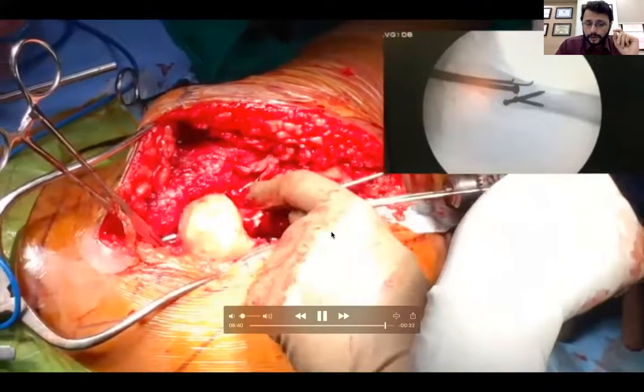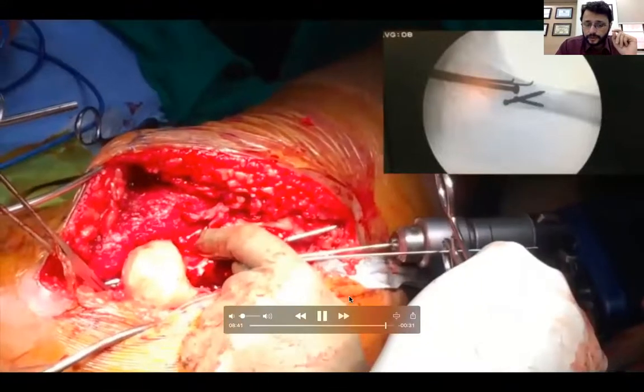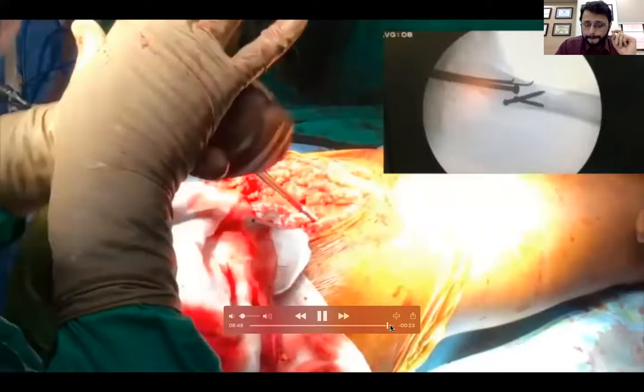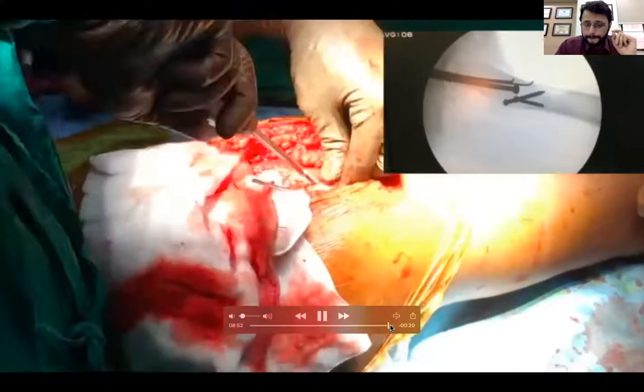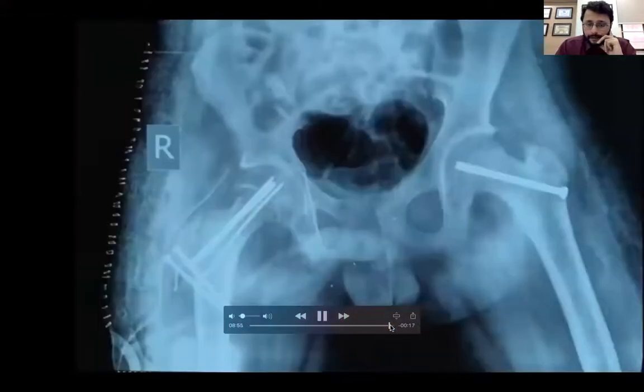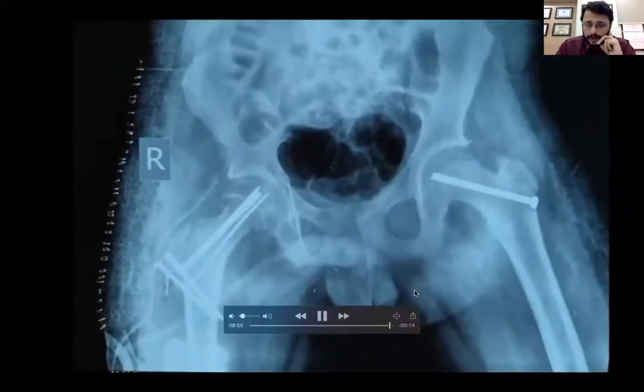All right. So this is where I'm fixing the trochanter. And this is the reduction. The other side required an in situ fixation.